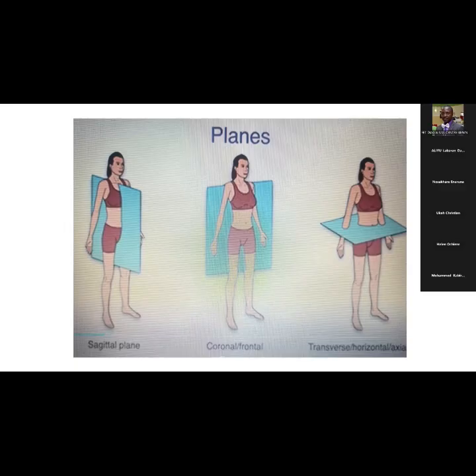So if it's passing through the abdomen, for example, it's going to have one part of the liver on the one side, on the right, and a small amount of it on the left. Something like that. So if you move a little more to the right, then you start to see more of the liver. So that's how that works.